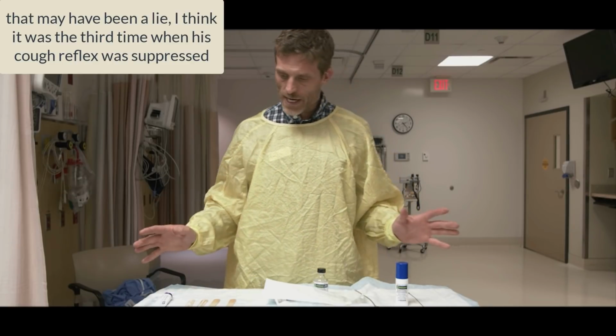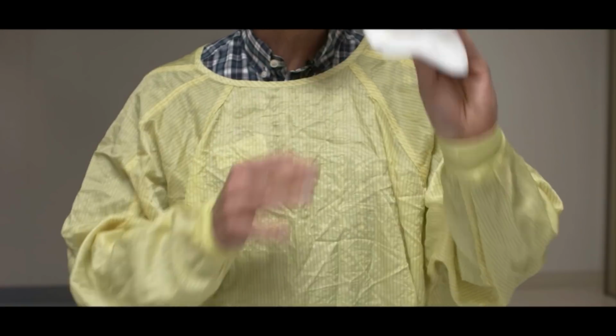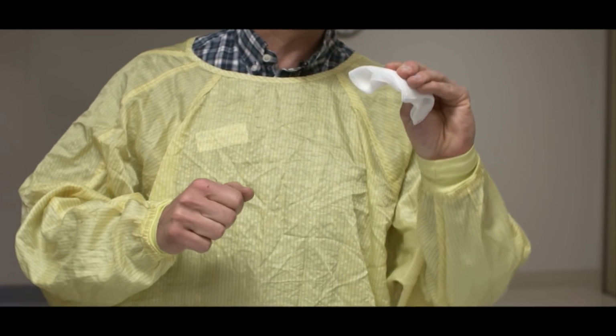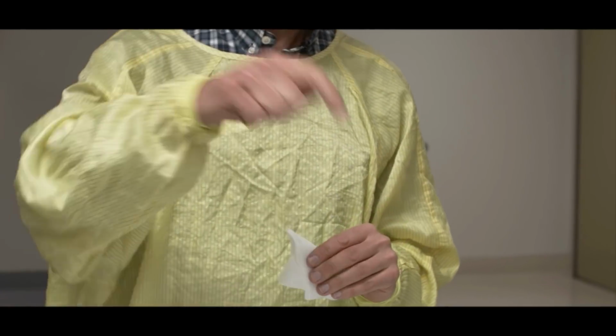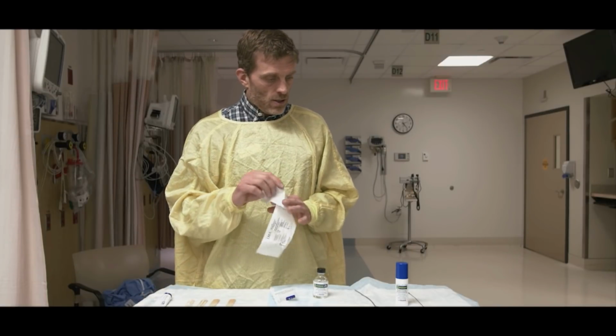So I think that's it for lidocaine. Oh, the other thing on this tray is this. I think this is very important. It's very hard for someone to voluntarily stick out their tongue and hold it out there. So just grab onto it, and you'll be able to pull it out quite far and get that ointment very, very posterior. Okay, so we'll end it there.